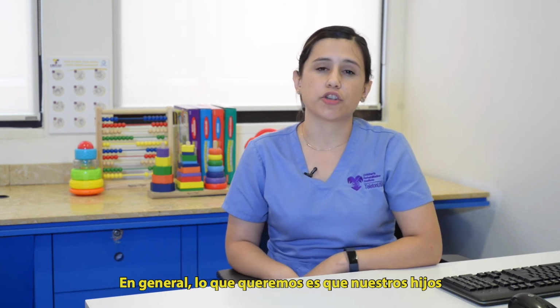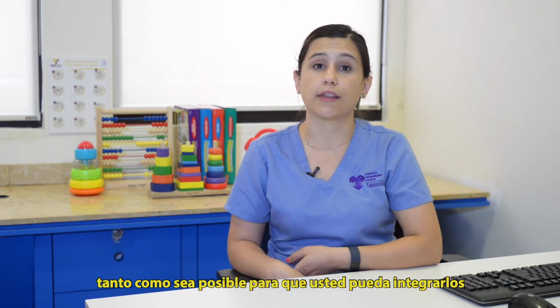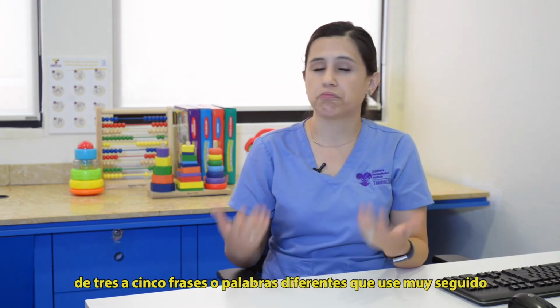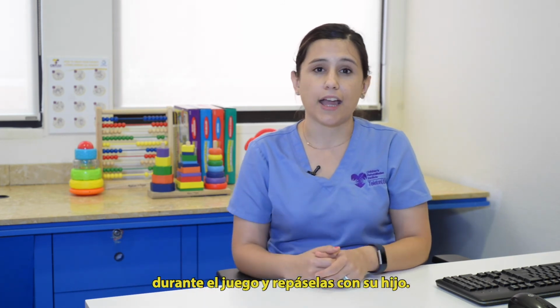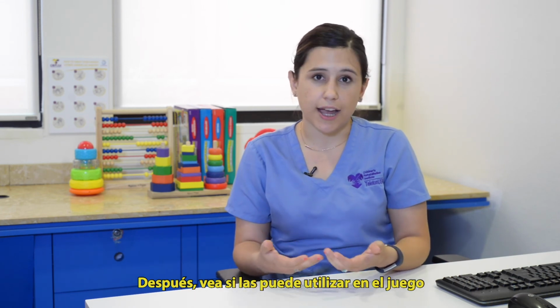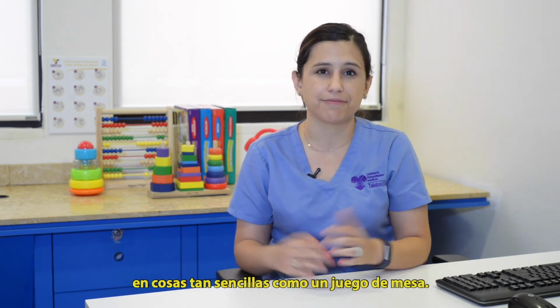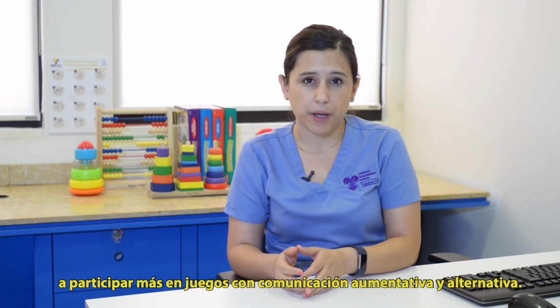Overall, we want our children to use their AAC devices as much as possible, so you can integrate them into board games. If you're playing any game, pay close attention to what kind of vocabulary you use and pick 3 to 5 different phrases or words that are used very often in the game and review them with your child. After reviewing them, see if they can use it in the actual game. And this will help them feel more engaged and allow them to participate more in a really simple thing like a board game. So those are some really easy ways to help your child participate more in games with their AAC.